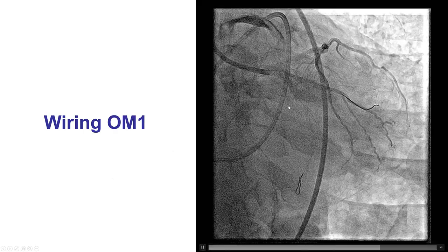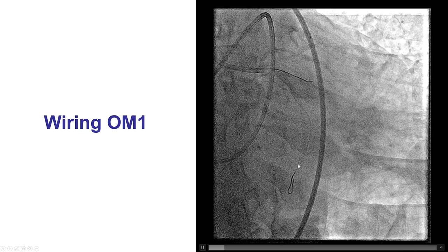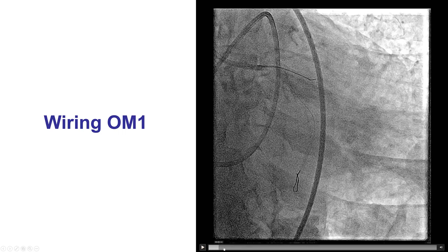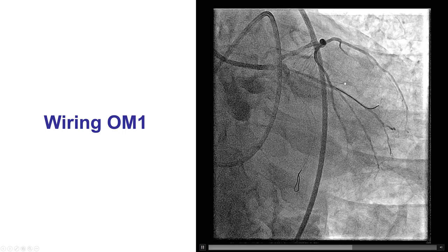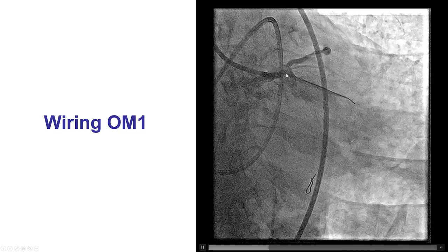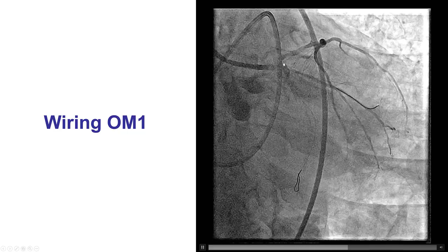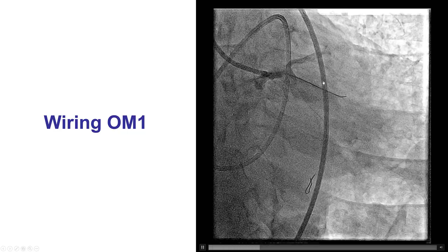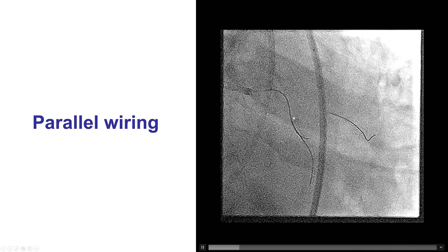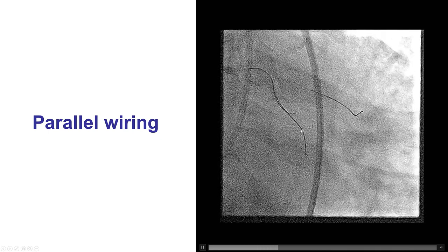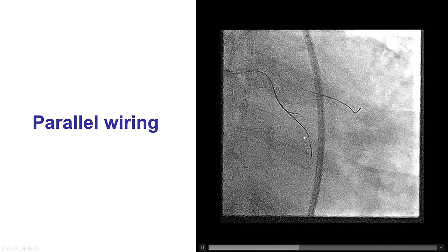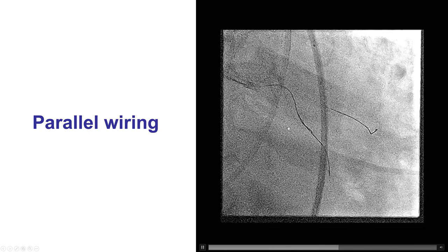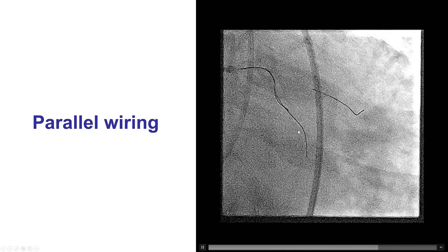In this particular case, we tried to advance the wire, but it was knuckled and entered the subintimal space. We inserted another wire into a large first obtuse marginal branch, and then tried with a second workhorse wire in the circumflex to get through the area of dissection, unfortunately without success.